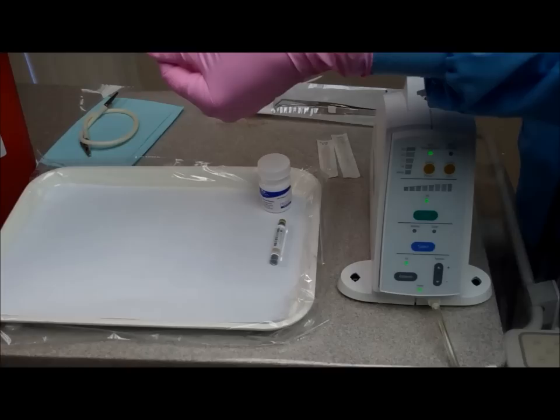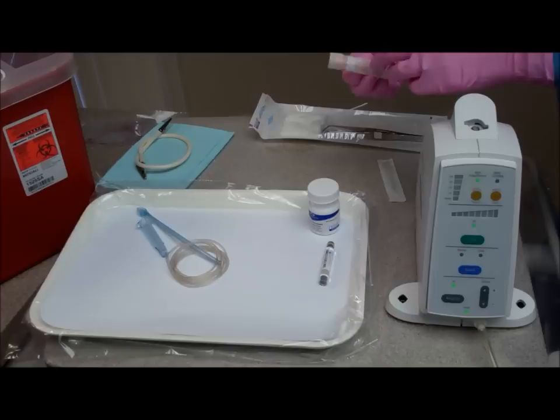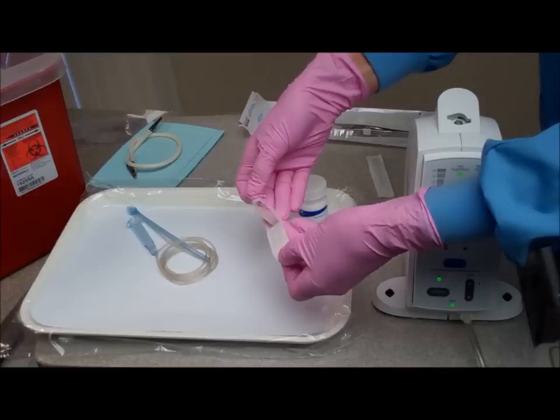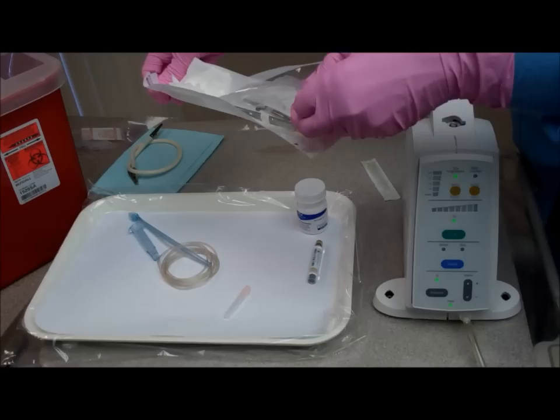Using aseptic technique, you unwrap the cord. There is a little tab at the top that allows you to open it easily. You are going to unwrap the cord, drop it on your tray, and select the appropriate needle for the anesthetic injection. In this case it is going to be the short needle. Then you are going to take your sterile items and also place those on the tray.